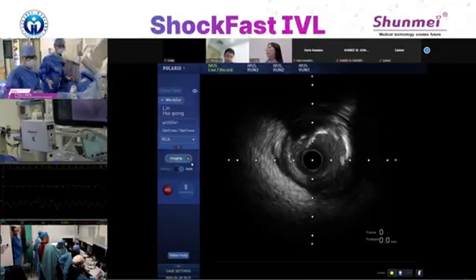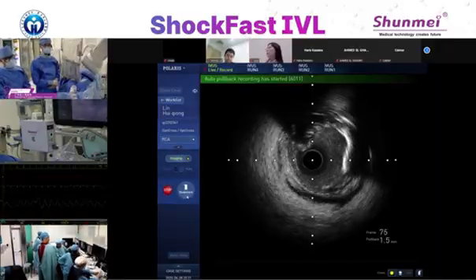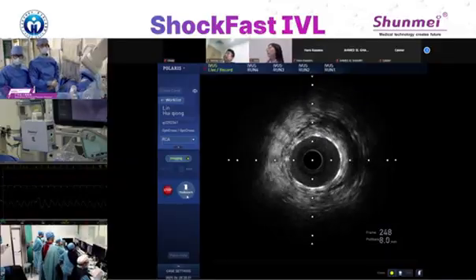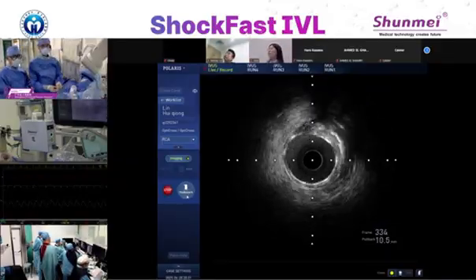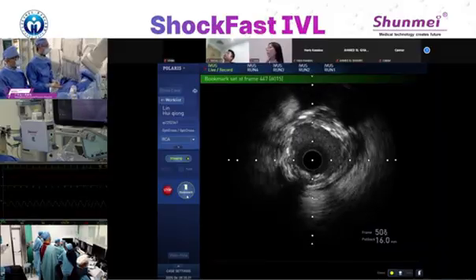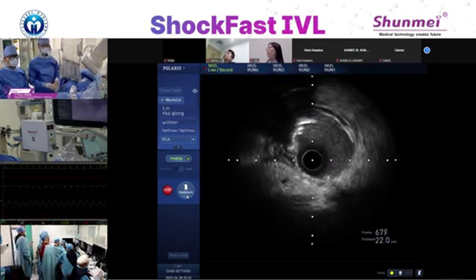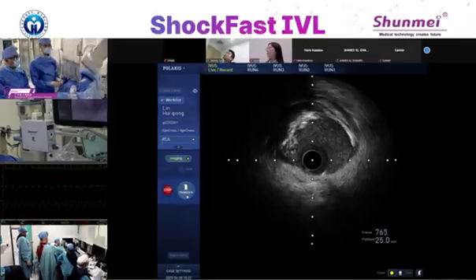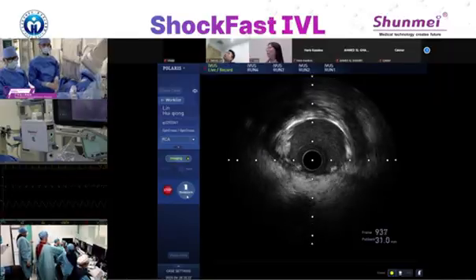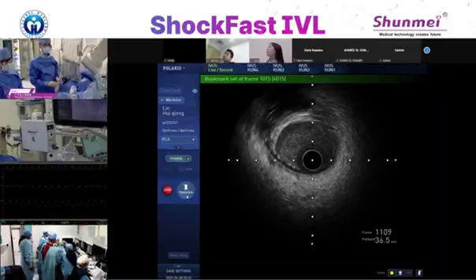Yes, there is still some calcium. Here, that's the distal edge of the stent. Looks not bad. The middle segment we post-dilated with the 2.75 by 26 or something. But still there is a waist over there at the distal mid portion of the stent.